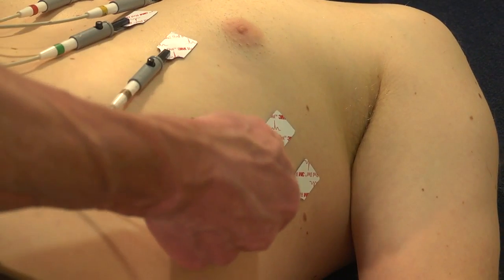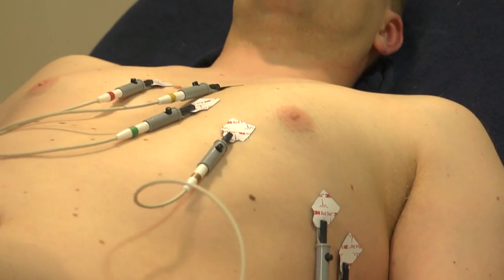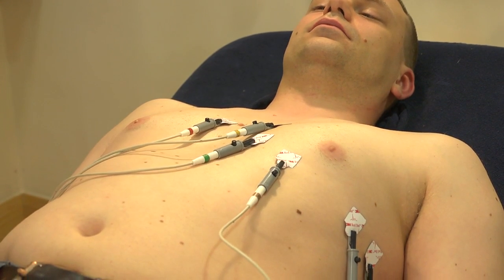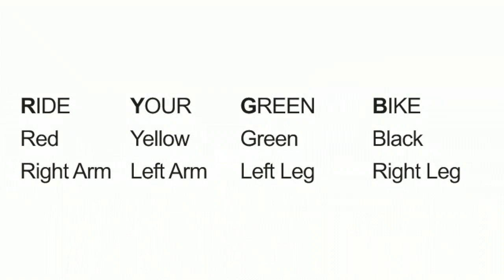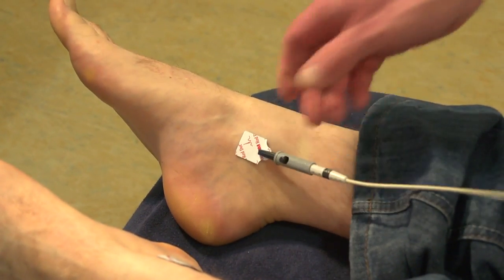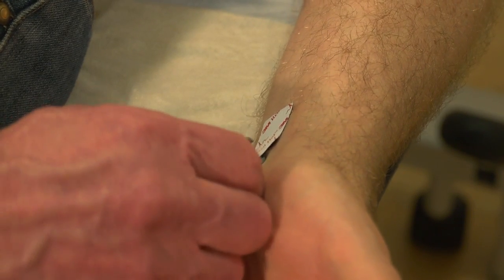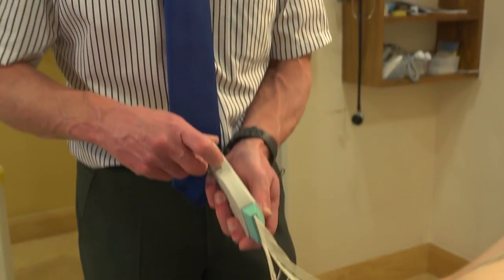Are you comfortable there, Martin? — That's fine. Please let me know if any of these come loose, because you'd possibly notice before I would. I'm then going to attach the limb leads. On the right-hand side, red is always on top — following the mnemonic 'ride your green bike' — so red goes on the right arm, black goes on the right foot as the neutral, yellow goes on the left arm, and green goes on the left leg.